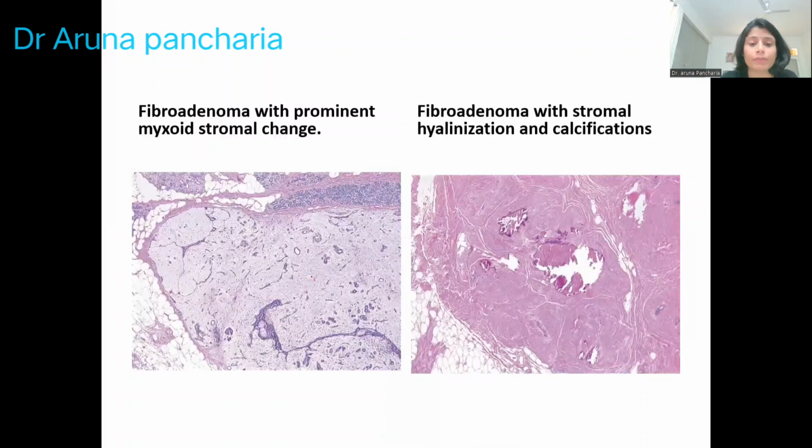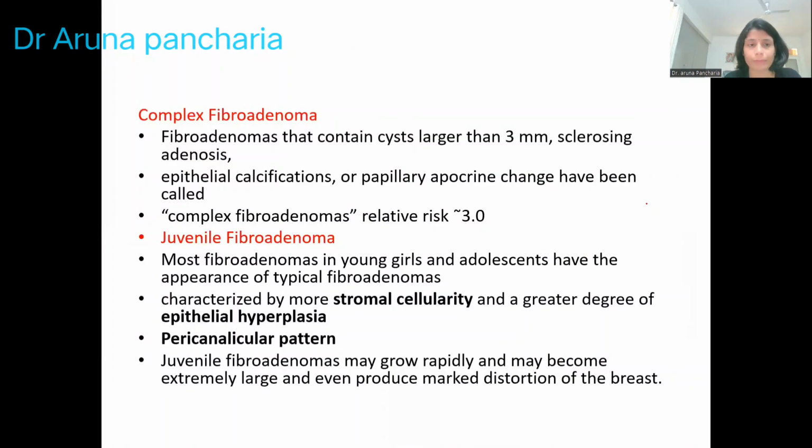And here you can appreciate a bluish hue. So it is a myxomatous change. Here there is a calcification. So these are certain changes that may be there in the fibroadenoma.